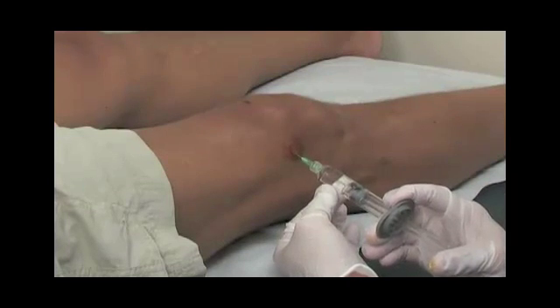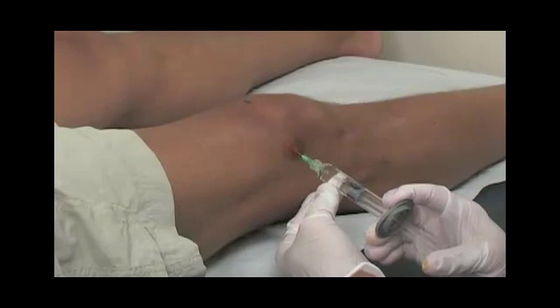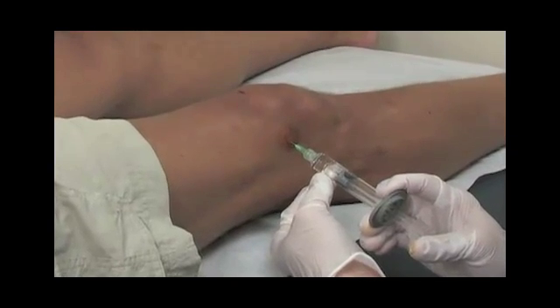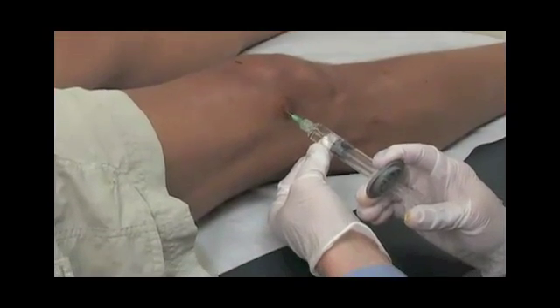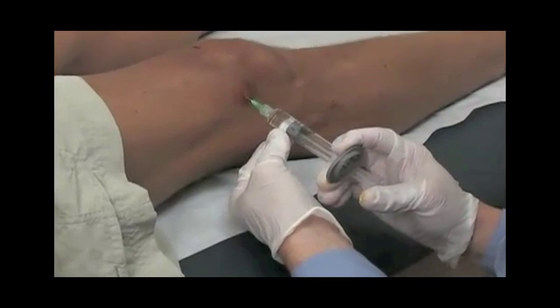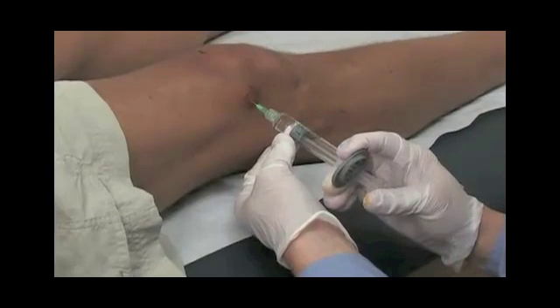We'll then place the Synvisc-One into the knee joint slow and easy. While we place the injection, we're always ascertaining feedback from the patient on whether they're experiencing any pain or discomfort. They should not.